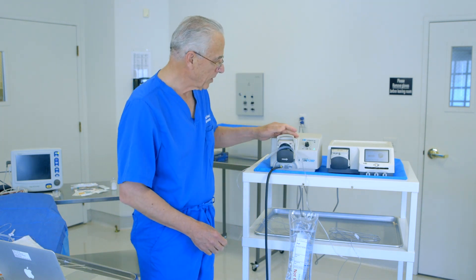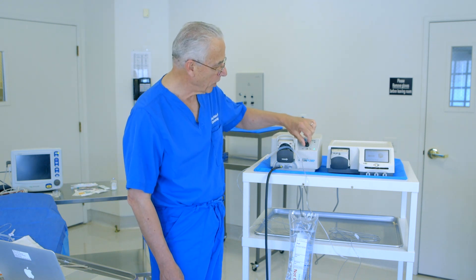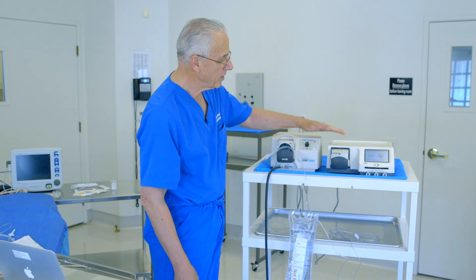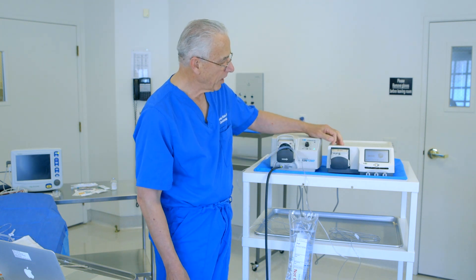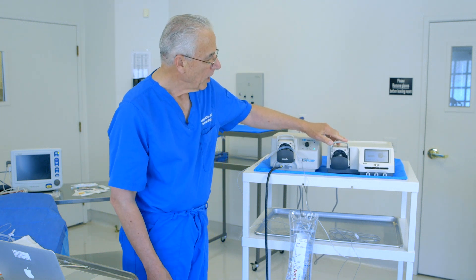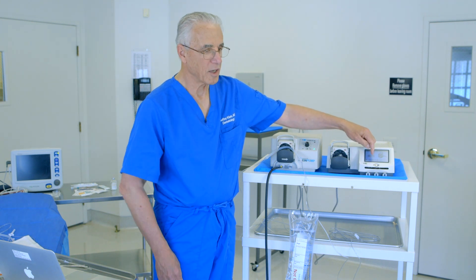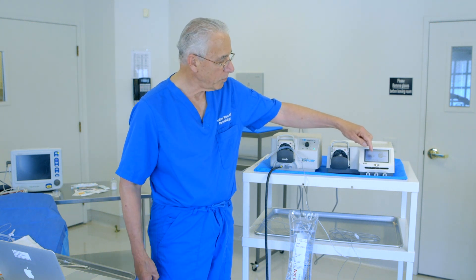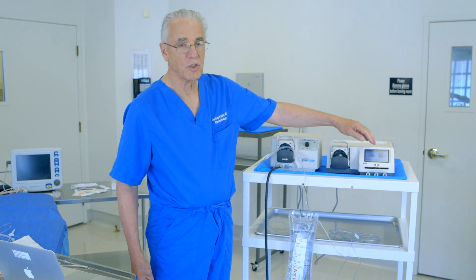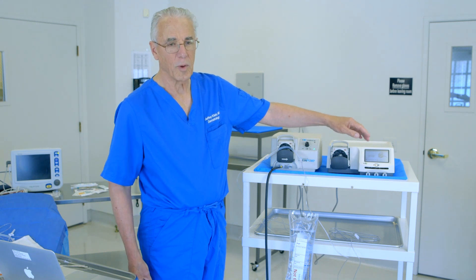This is a tumescent infiltration pump — this is an analog pump. It has a simple dial to change the rate of infiltration. This is a more sophisticated version: a digital version where you can select the exact number of milliliters per minute flow rate and even choose the exact volume you want to infiltrate before the pump stops.